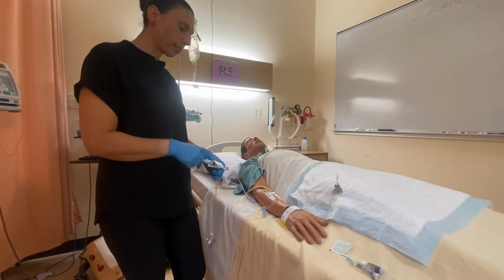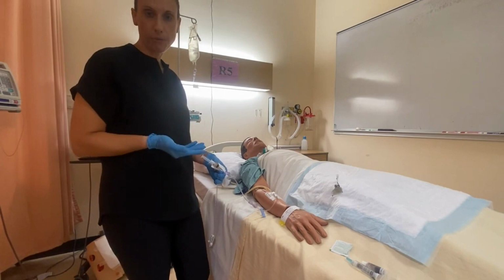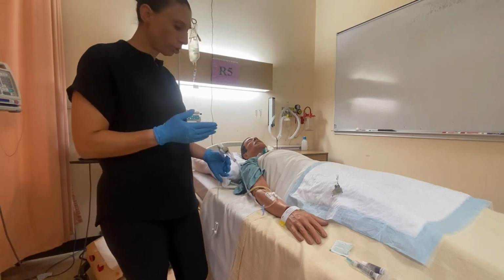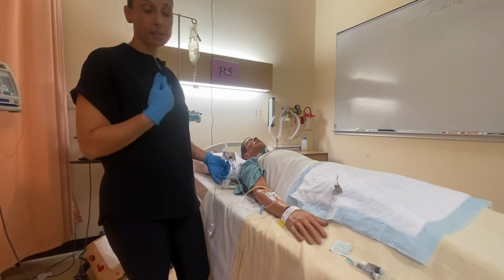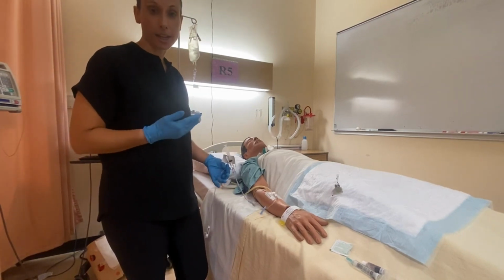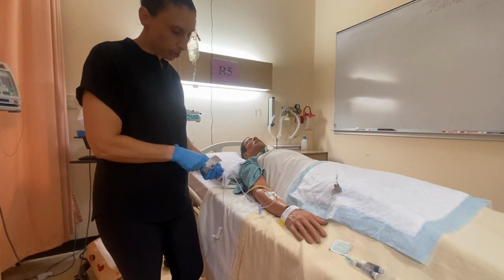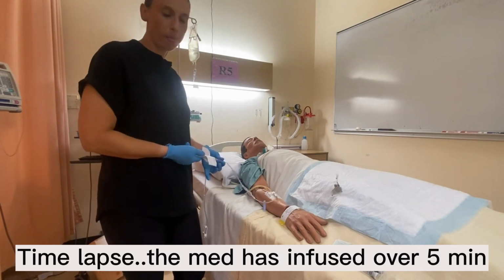So if we were giving this for 4 minutes, we would be pushing 1.25 mLs every 1 minute, okay? So it's up to you how you want to calculate it. You can choose a pause time of 1 minute or a pause time of 30 seconds. I chose 30 seconds. You can use a pause time of 20 seconds or 15 seconds. It's completely up to you. You would just have to do the specific calculation. So after 30 seconds, another 0.5. So I think you see where I'm going with this. We would just keep going until the whole medication is in.